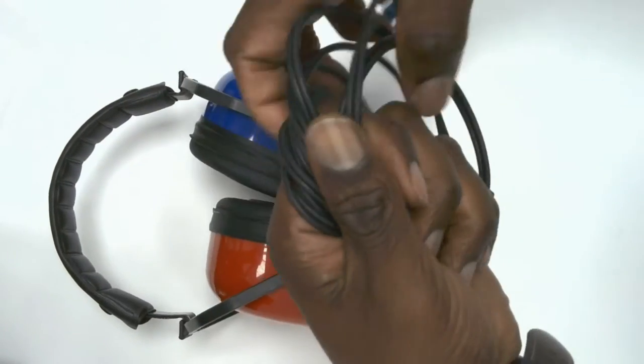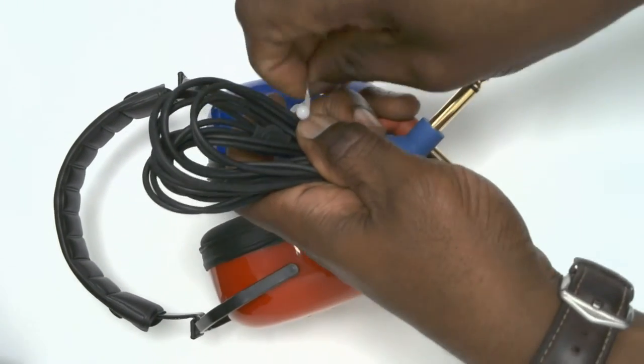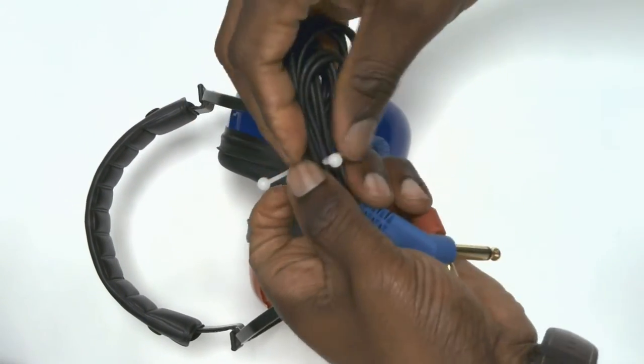It's very important to take care of the headset leads by keeping them straight and folded, and securing them with a cable tie or elastic band. This will ensure that the junction where the leads enter the headset is not under stress.